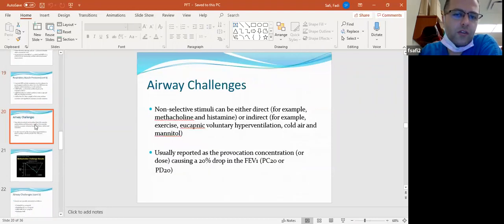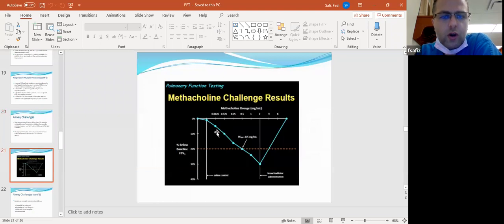Now, airway challenge, I don't know if you will get questions about airway challenge. Just one thing you need to remember about airway challenge, which is, it's a dangerous test, by the way. You don't want to do it for somebody who has active obstruction. So any patient who has an FEV1/FVC ratio below 65, you do not continue to give him more bronchoconstriction because they may go into respiratory failure. But remember, it will cause a 20% drop. 20% is the amount of the drop. And this is the concentration of the medication.